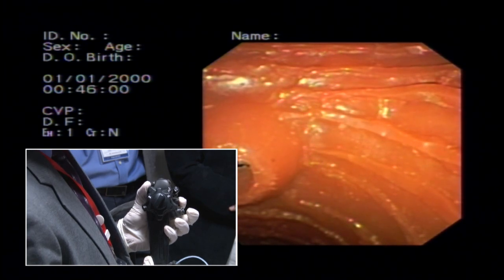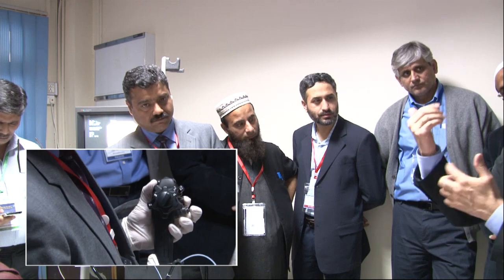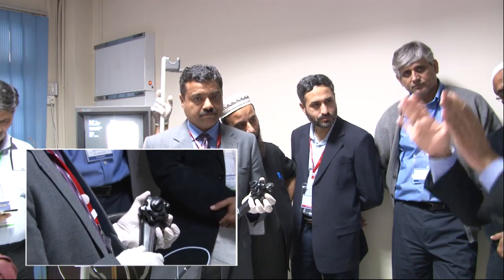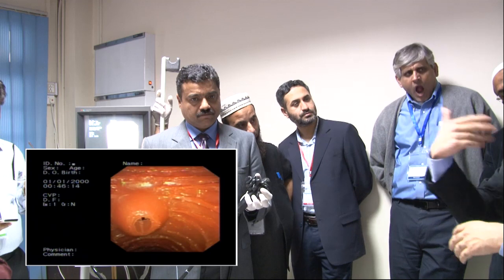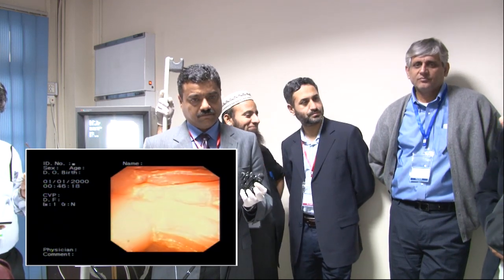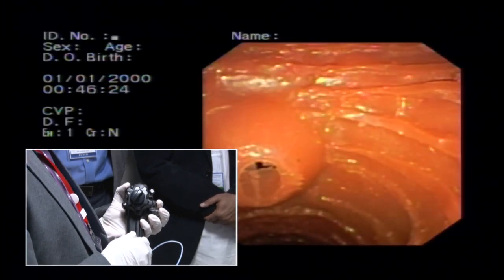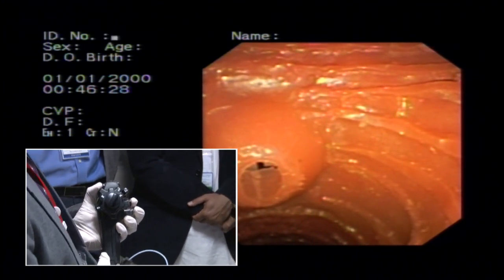Sometimes bile starts coming out. When you're suctioning the air from that water, that creates a little vacuum there and kind of pulls the bile out. So you can see that, especially in those ampullary masses, you can see where the bile is coming. And with those, I try to use the wire, that's what I use instead of cannula, because if you keep pushing it into hamburger meat, you can just keep making holes with the cannulas.